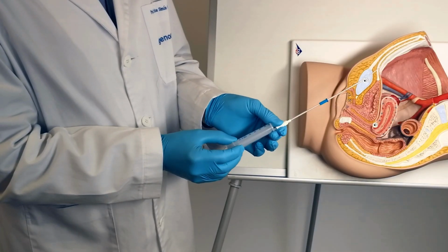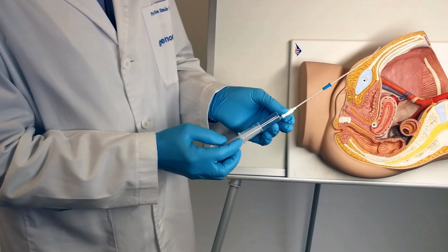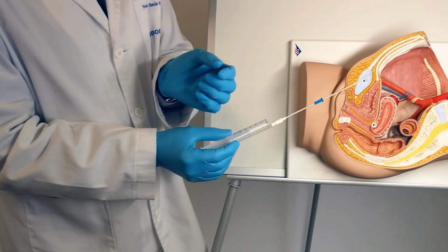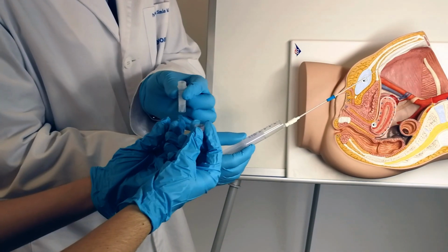As the plunger is back to the original position, the syringe must be disconnected from the catheter to gather some air, discharging the liquid against the internal side of the tube.